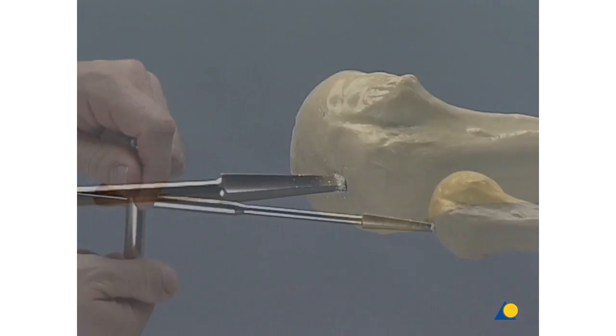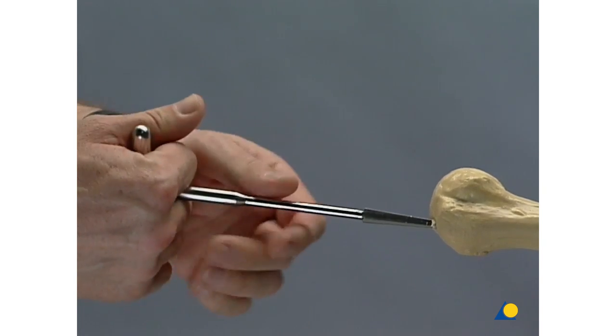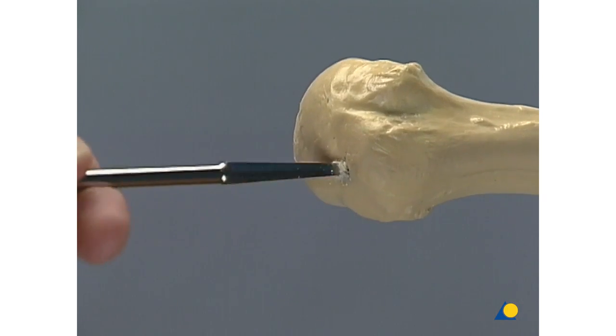Loosen the screw to release the Kirschner wire and open the medullary cavity.